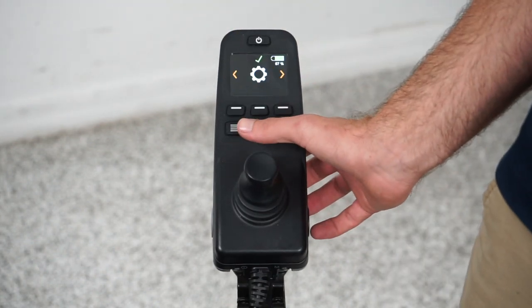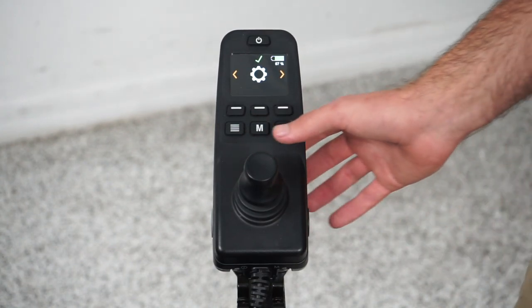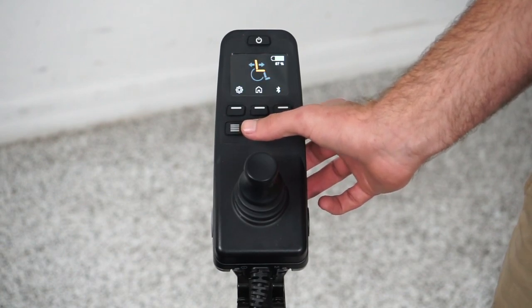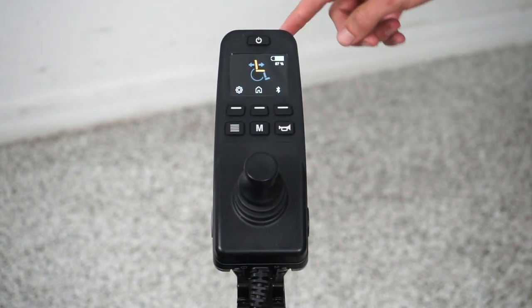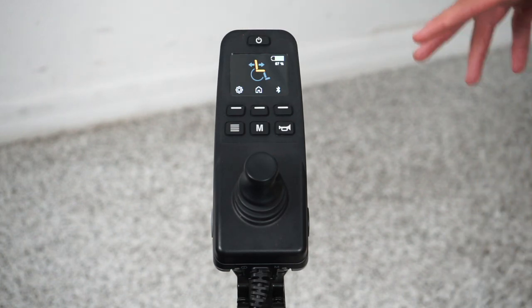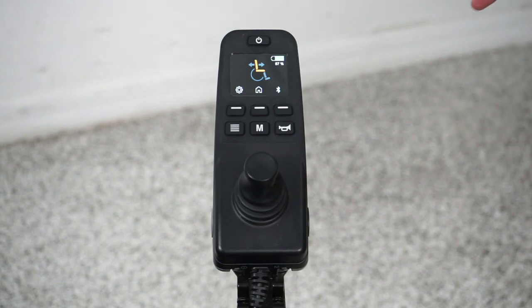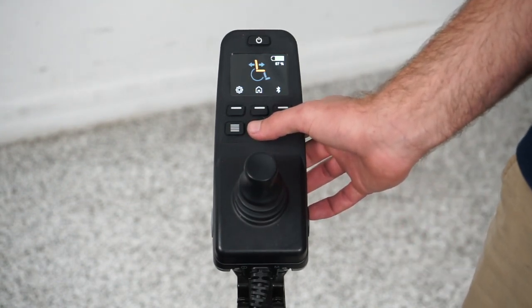If I keep pressing mode, we get to the setting menu, which I'm going to cover later in the video. If I press mode again, I'm now in the function menu. This function menu controls your seat lift, tilt, recline, or legs on your chair. I will cover that later in this video as well.